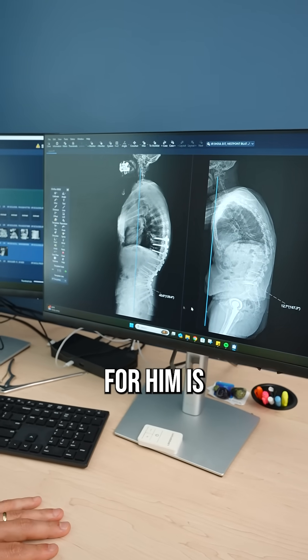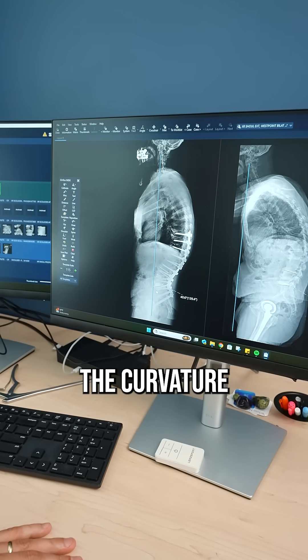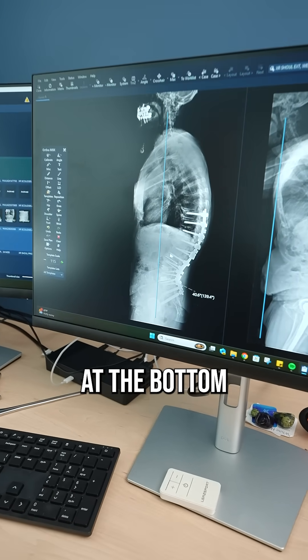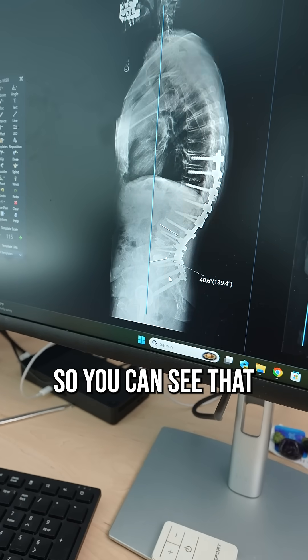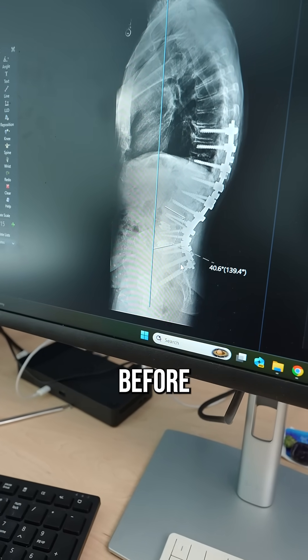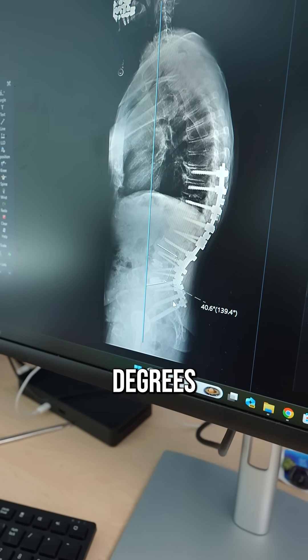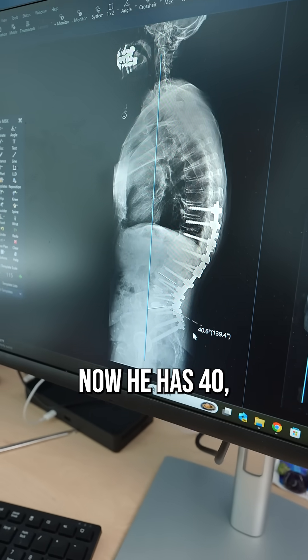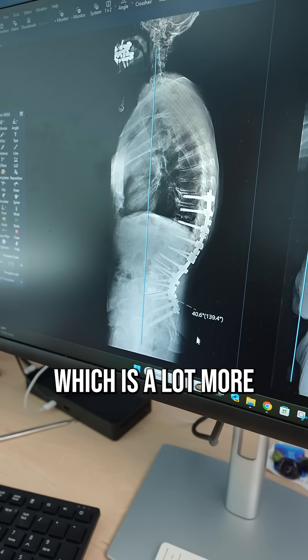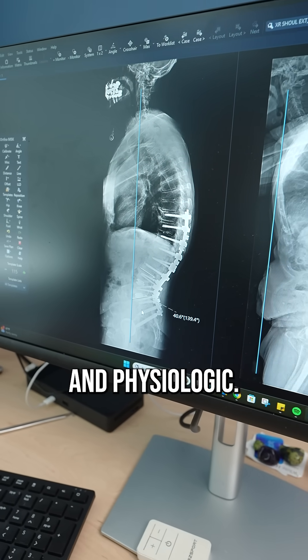So what we did for him is we restored the curvature at the bottom of the spine. You can see that before he had almost 13 degrees of lordosis, and now he has 40, which is a lot more anatomic and physiologic.